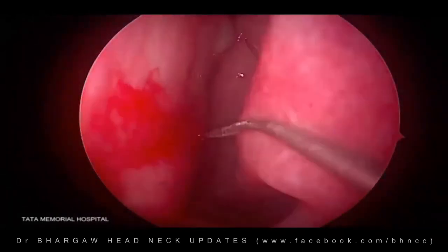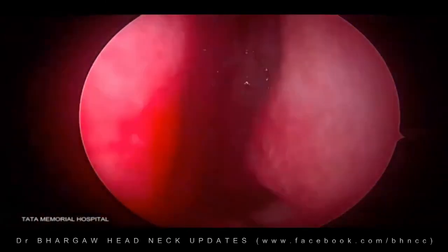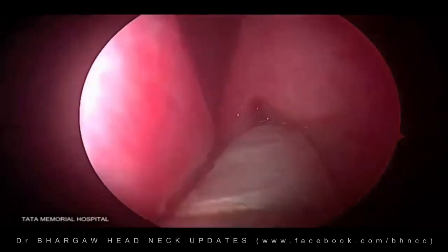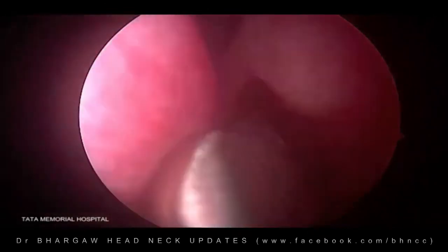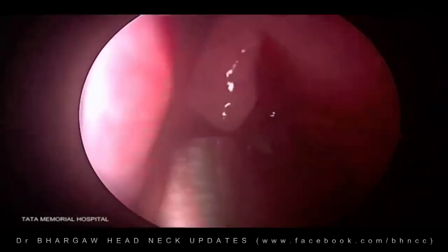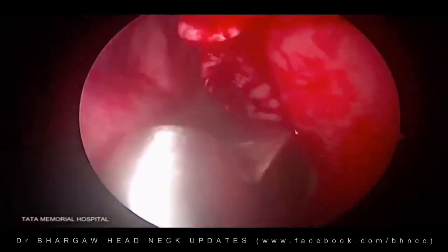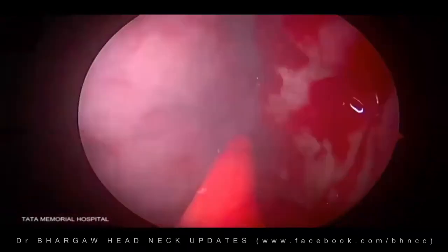So we thought we would use the Hadad flap as one of the layers for reconstruction once the defect is done. As you all know, if you have to do that, you have to do it at the very beginning. But we started off with a middle turbinectomy because there was an access issue going posteriorly, with the spur coming in touch with the middle turbinate. We did the middle turbinectomy to improve the access, and it was required as part of the craniofacial resection anyway.